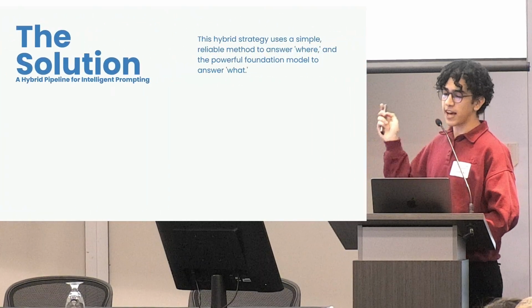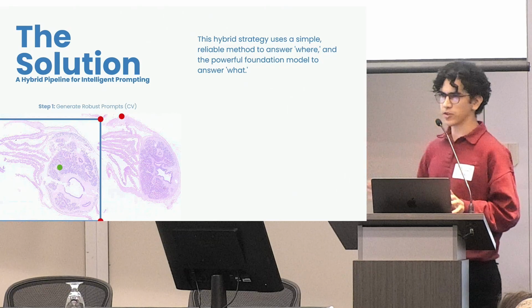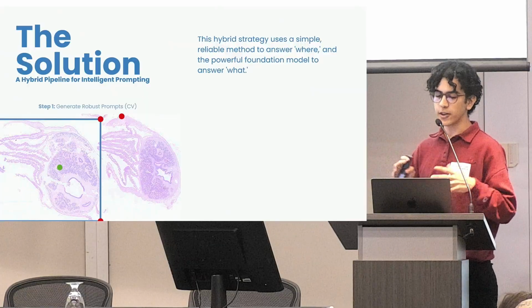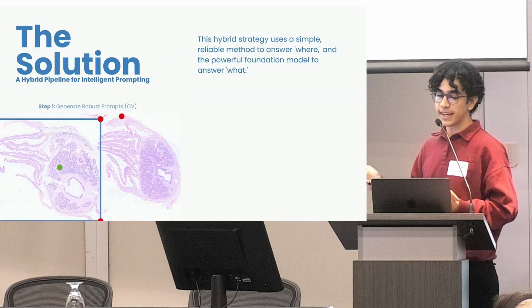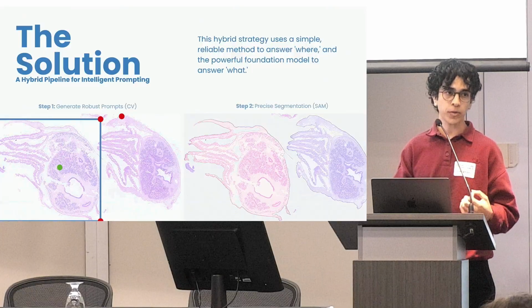Our first step answers a simple question. Where is the tissue? I wrote a script that quickly scans a lower resolution version of the slide and then looks for the general location of the oysters, and it generates a set of simple prompts or instructions for the next step.